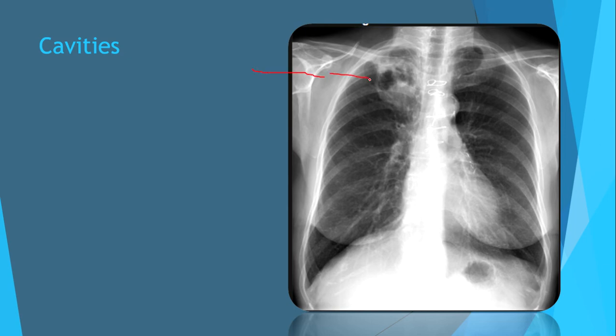Those who look precisely can see the picture of the tumor with cavity. This is the cavity, the darker area.